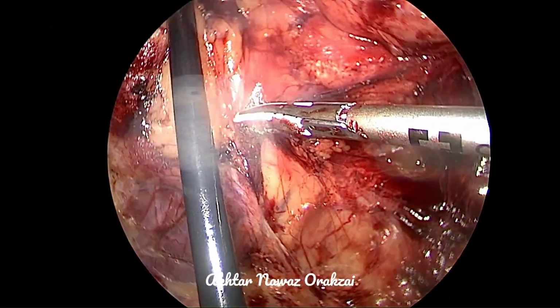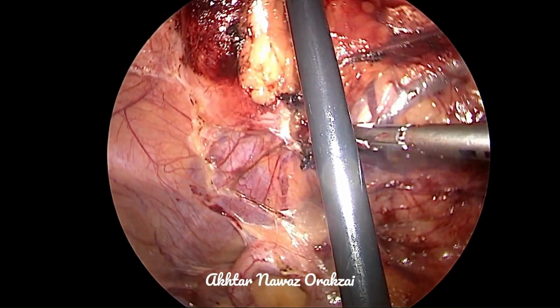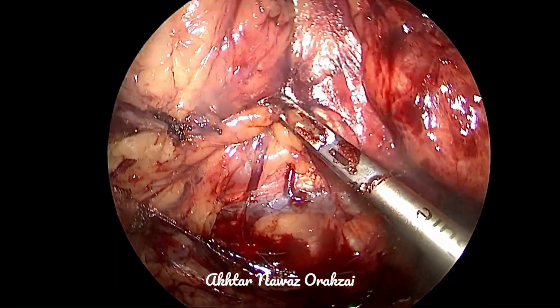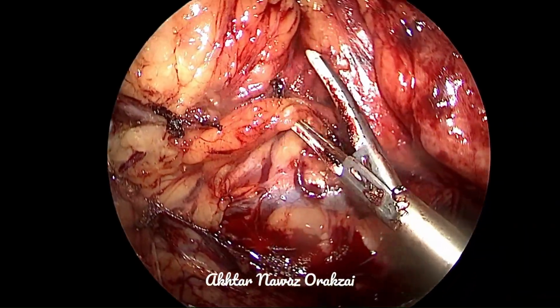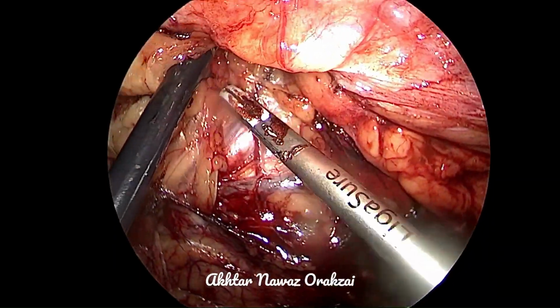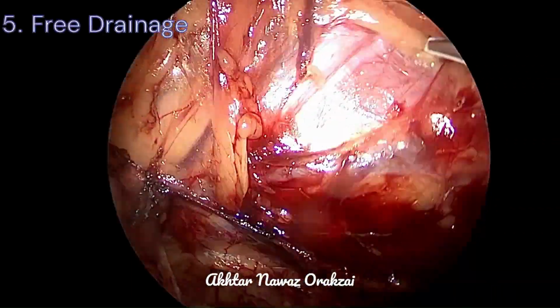Then the anastomosis of the ureter must be performed at the dependent portion of the pelvis, because we all know there is a congenital condition called high insertion of the ureter, where it may present as PUJ obstruction. So the anastomosis should be in the dependent area, so that gravity may also help the urine move from the pelvis into the ureter. So it has to be implanted in an area which is dependent.